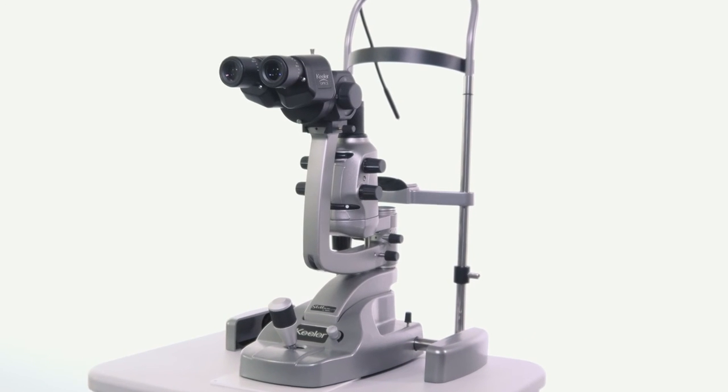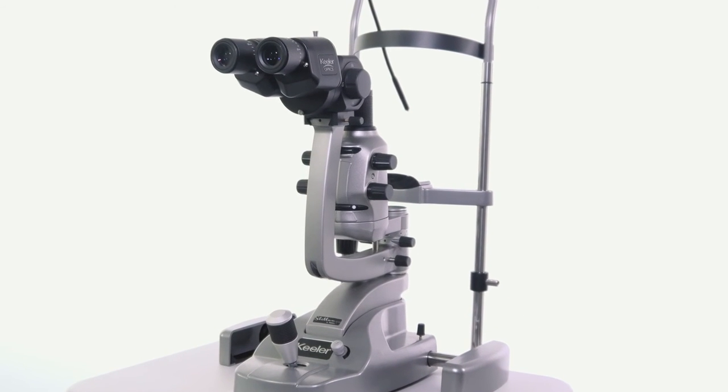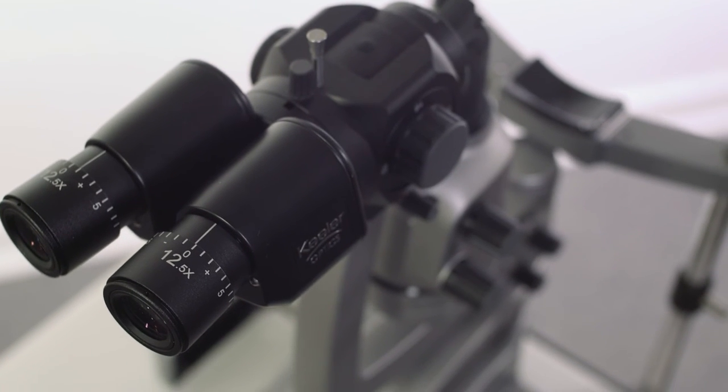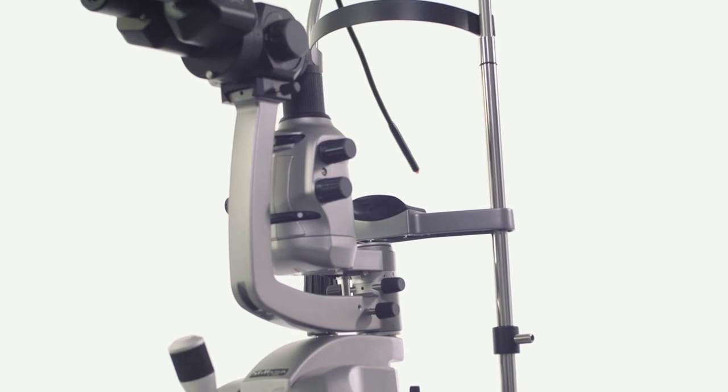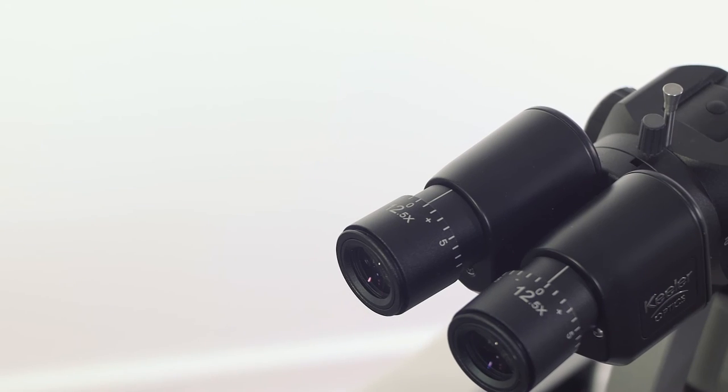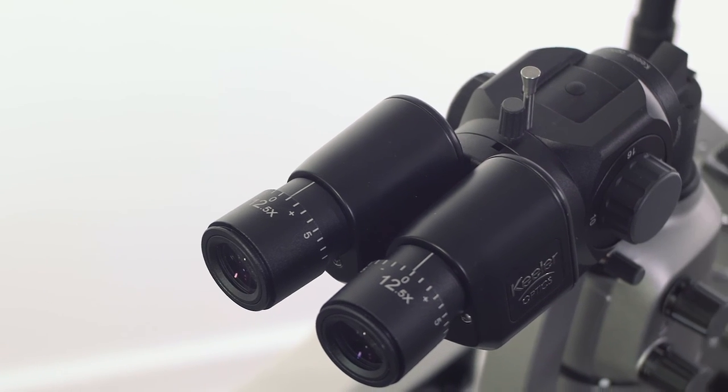The Keeler Z-series is our lower illumination compact slit lamp. It features a full range of Keeler exceptional optics. This product also comes in a digital ready form that offers the same features but can seamlessly be upgraded to a full digital system.